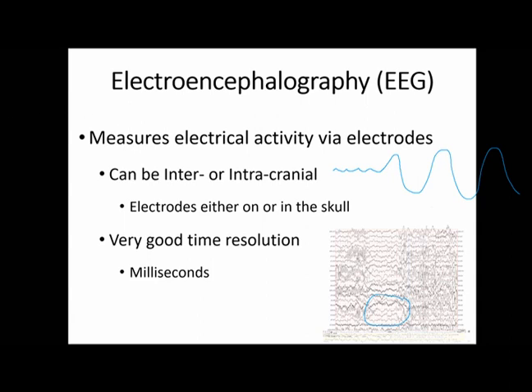And if we look on our EEG at the bottom here, you can actually see that we have really high responding here, but some other areas, like say this one line here, don't have lots of activity. So they might have asked a person a question at this time, and only certain parts of the brain are showing really high responding in response to that question. So we could then say that these parts of the brain are involved in us formulating a response to whatever question was asked. So that's a different kind of take on looking at brain activity.